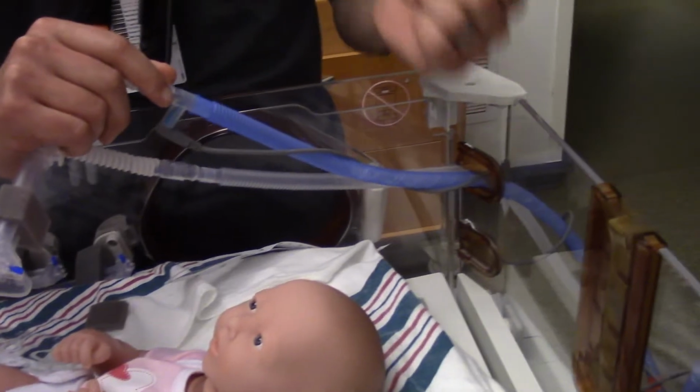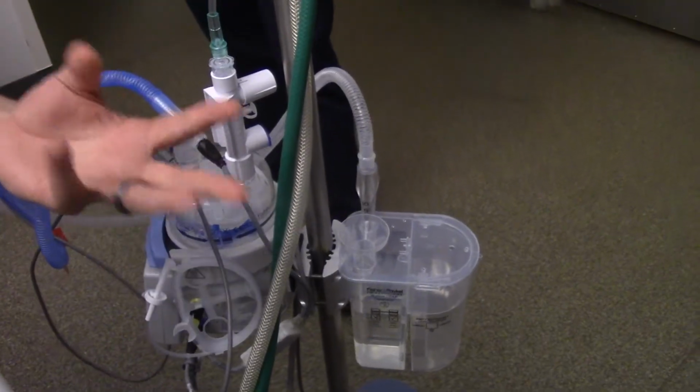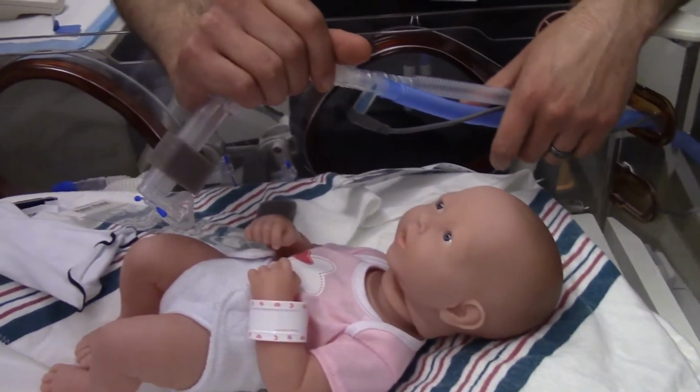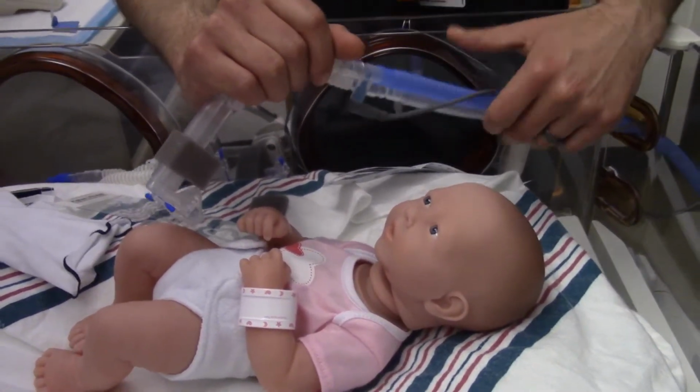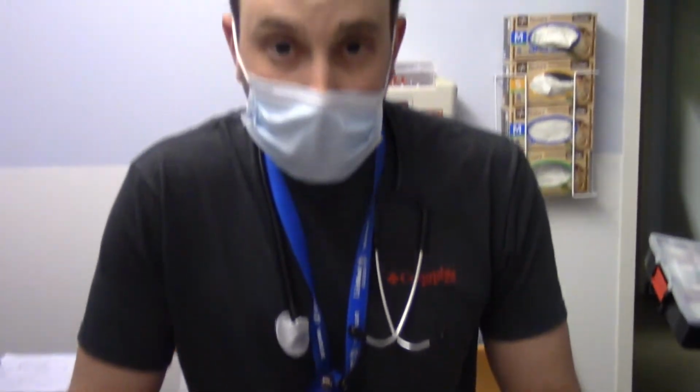It all happens in a split second, but we're using the bubble and the surface tension of that bubble when it pops, so to speak, to create that back pressure and that positive pressure. It all happens very, very quick, but it is a very, very gentle way of performing a continuous pressure.